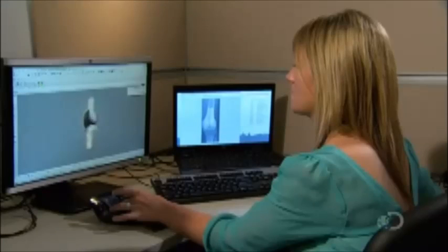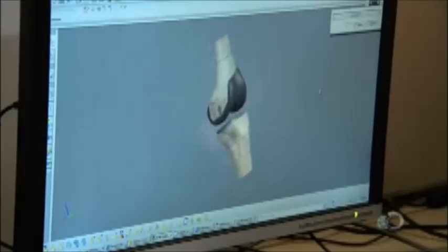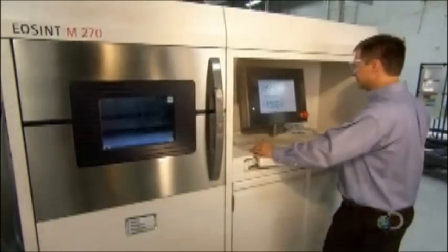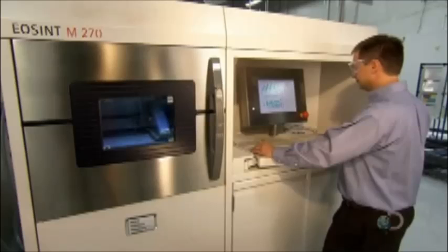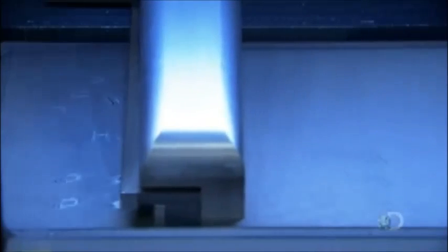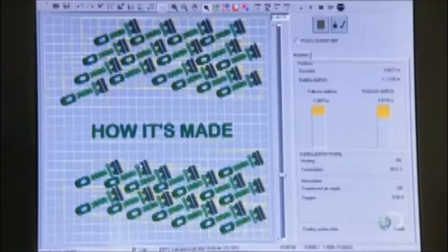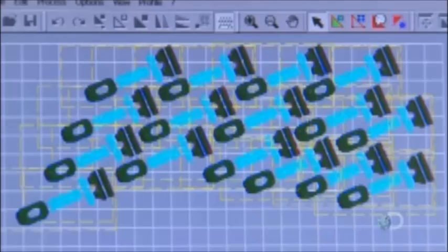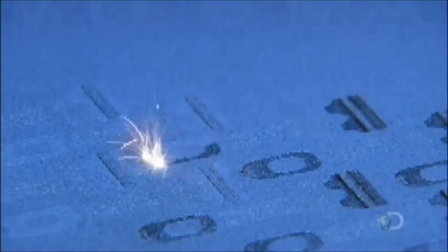During this surgery simulation, the computer records every bone cut. Only once the surgeon reviews and approves this surgical plan does manufacturing begin. The computer which recorded the bone cuts guides a 3D printer to produce plastic templates for both femur and tibia, which the surgeon will use to repeat these exact same cuts in real life.